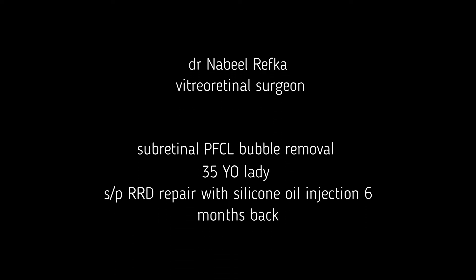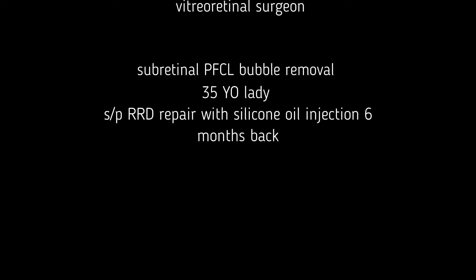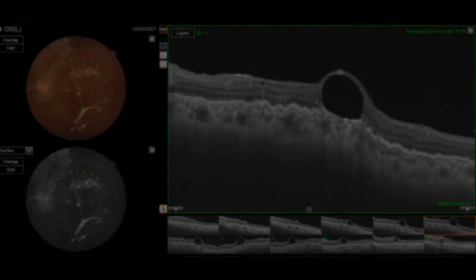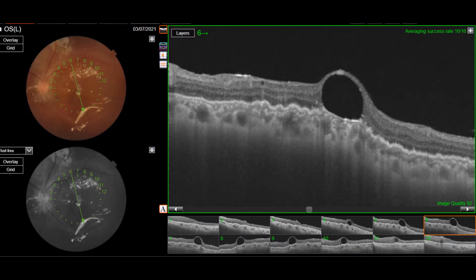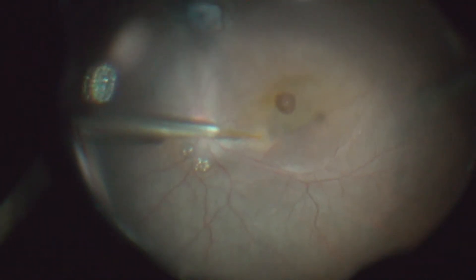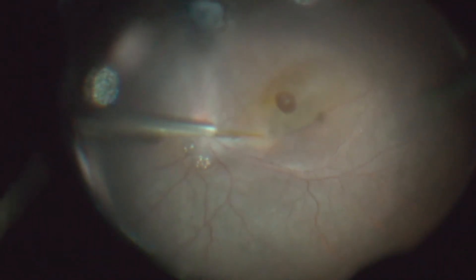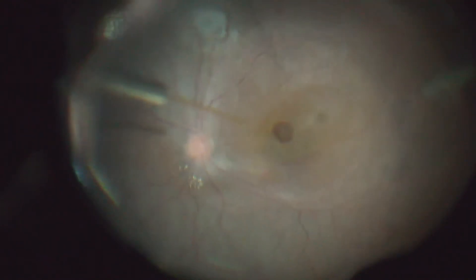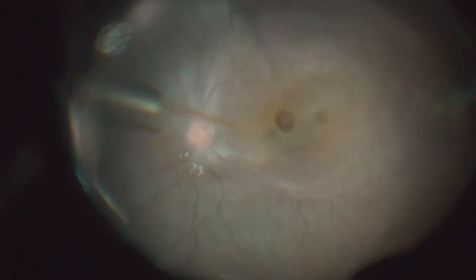During silicon oil removal, I plan to remove this sub-foveal PFCL bubble. After the silicon has been removed, I started with injection of BSS under the macula.